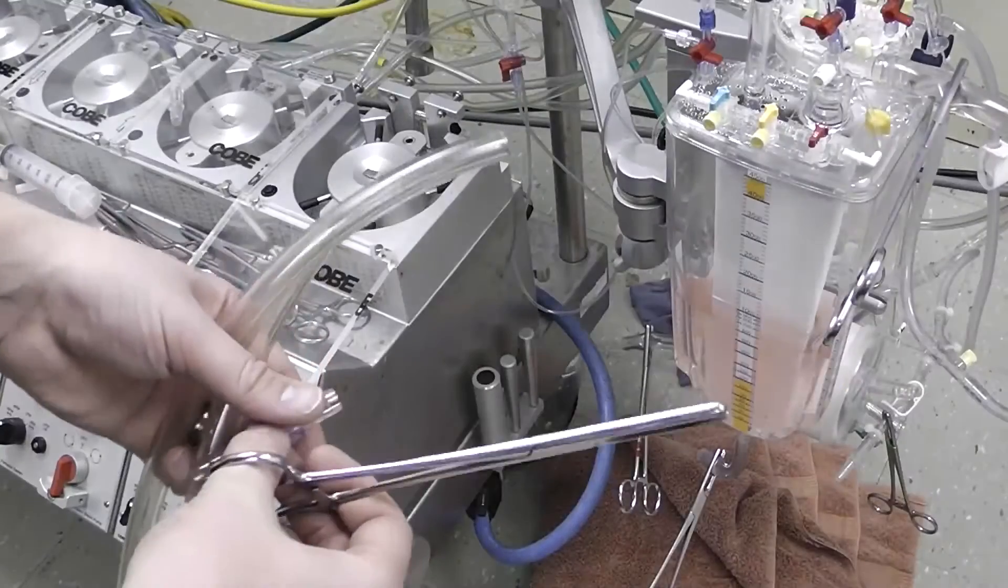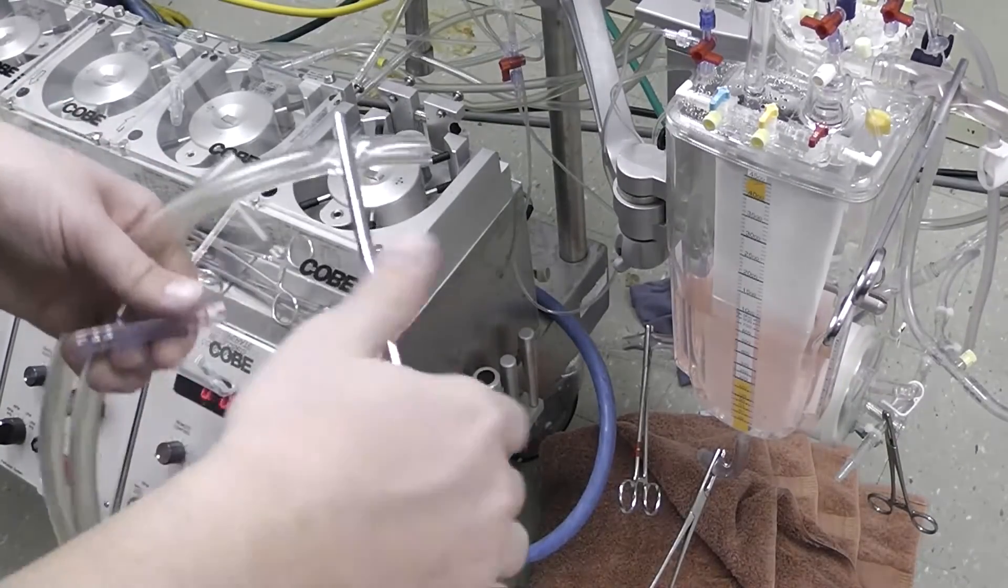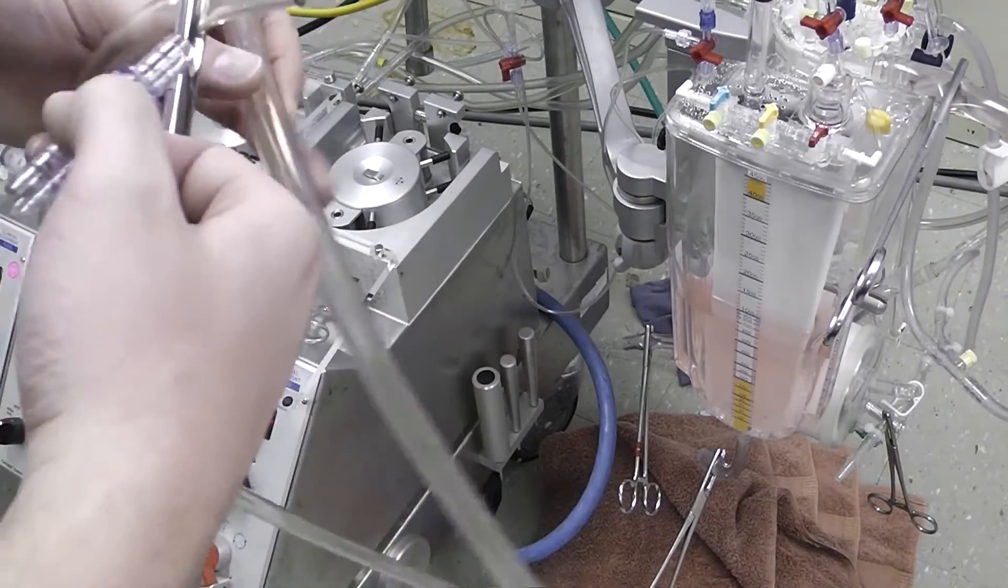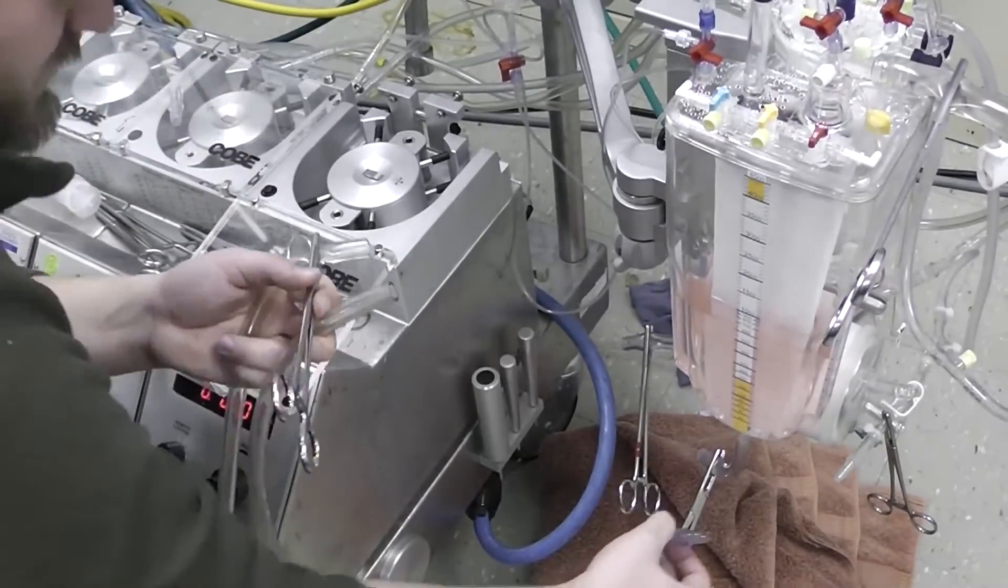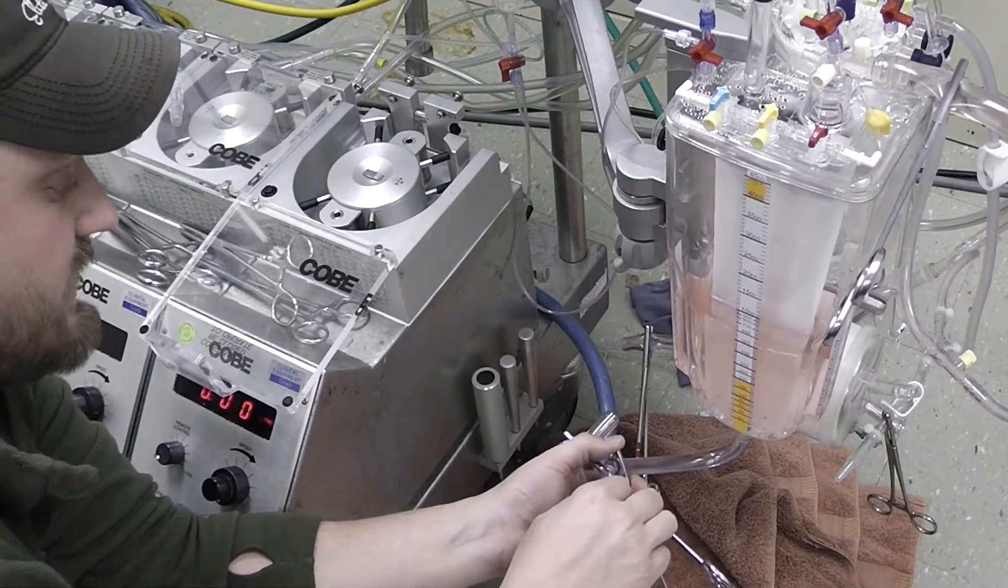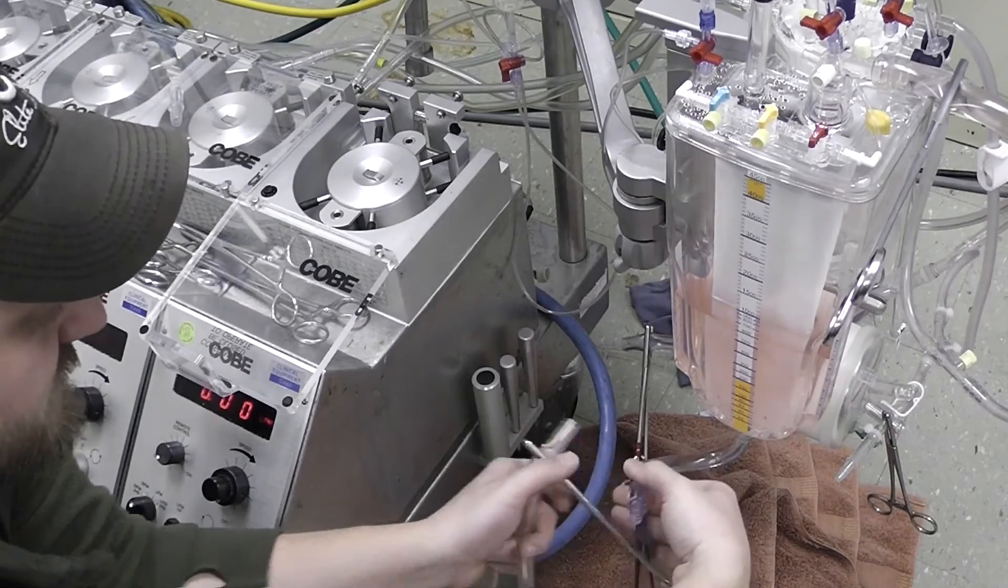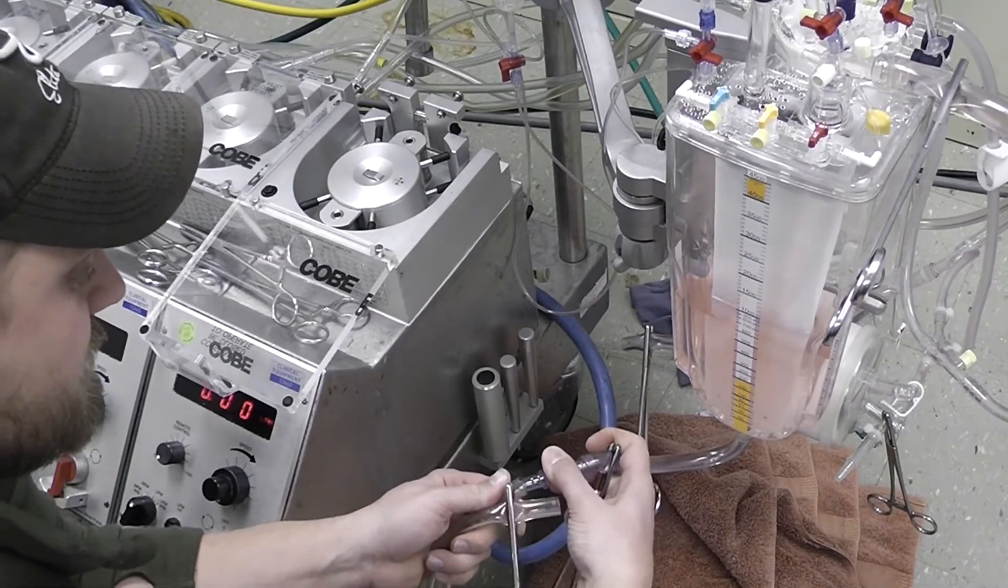Now we're going to take the new line and we're going to put a clamp at the distal end of it, and of course we're going to be keeping all this sterile. Then we're going to take a three-eighths inch connector and attach it to the outlet of the reservoir and attach it to the open end of the tubing.